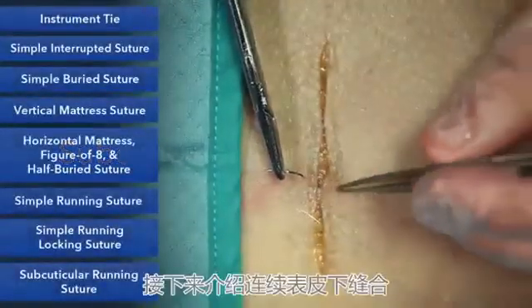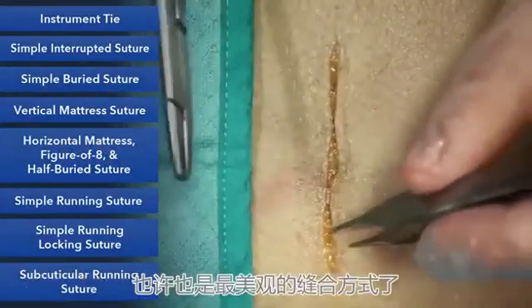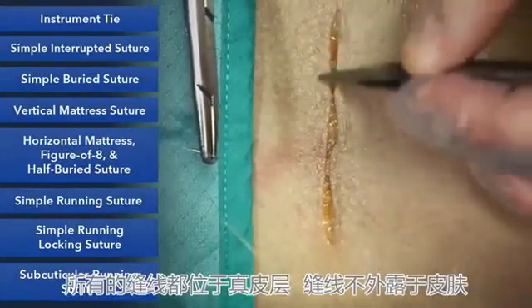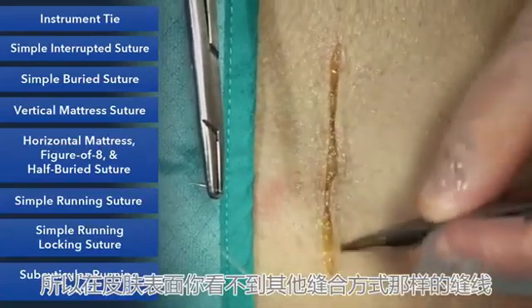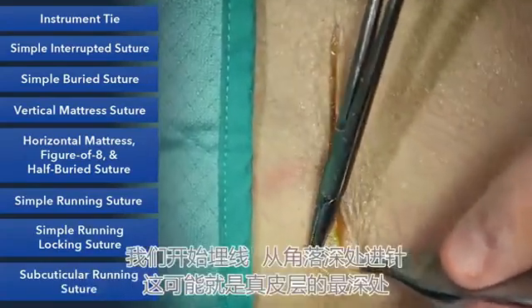Our next stitch is a running subcuticular suture. Out of all the sutures we're teaching you, this is probably the hardest to master. This is probably for the most cosmetic closure, as you're running deeply within the dermis, so there are no sutures on the outside at all. So you won't see any of the railroad tracking that you would see from any of the other outside sutures.